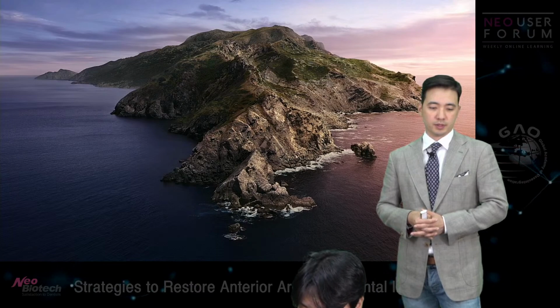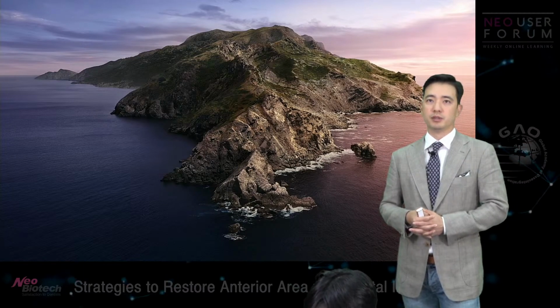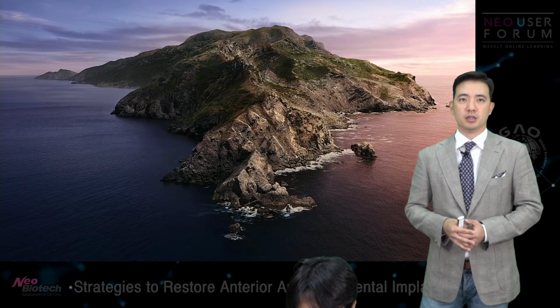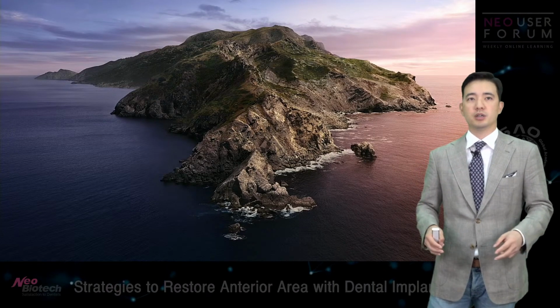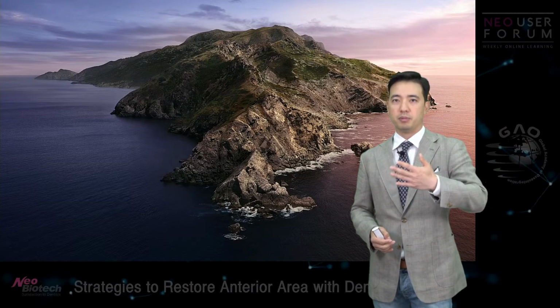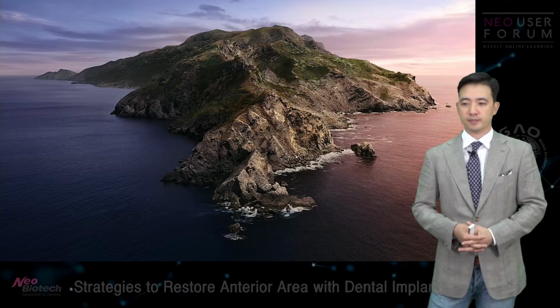It talks about the failure rate and the complications of the socket shield technique. One of the most common complications is shield exposure, which means the buccal part of the root can be exposed in some cases.